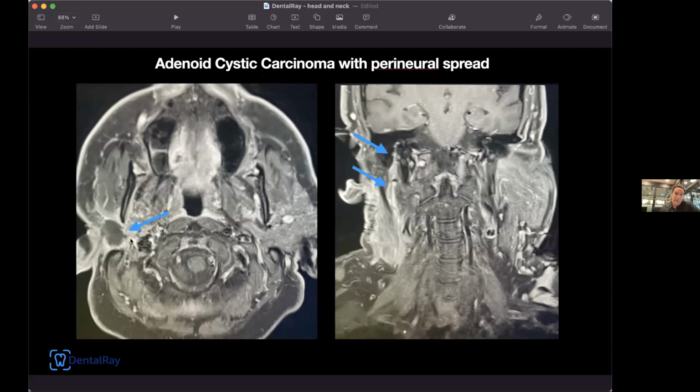That's here at the skull base, and unfortunately, it goes up. If we follow this up, these little blue arrows are pointing to, you can imagine, a kind of waterfall coming down right here. This is the stylomastoid foramen, where the facial nerve exits the brain and comes down into the face and courses through the parotid.